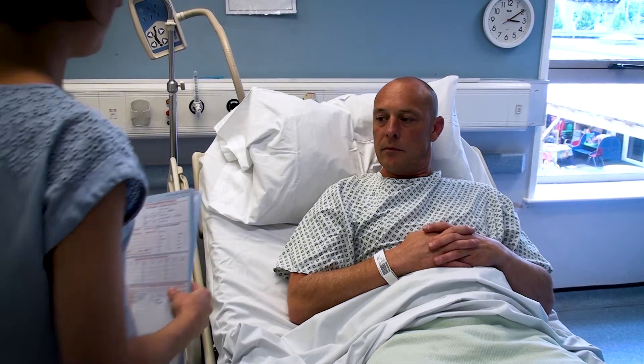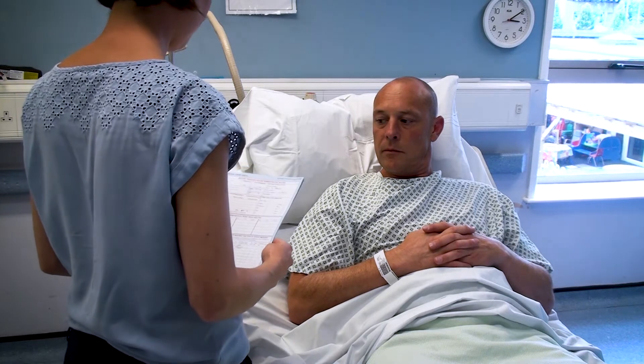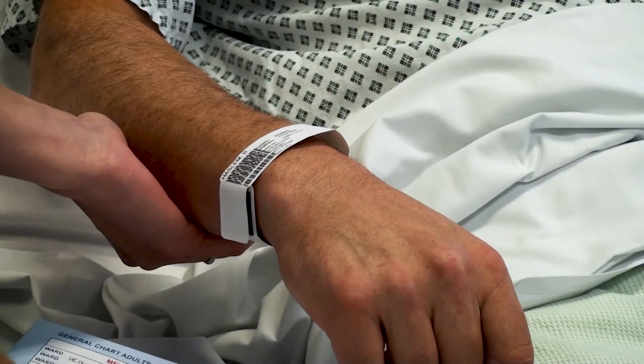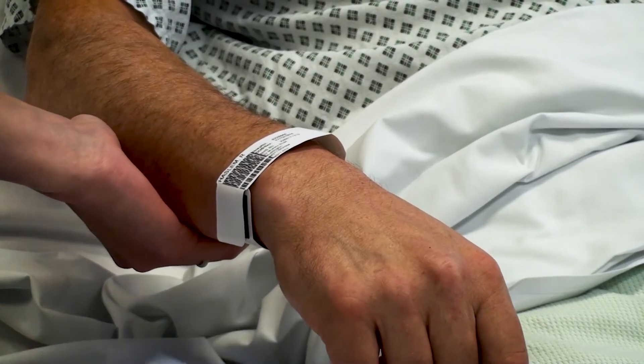Welcome to the clinical skills video for peripheral venous cannulation. Prior to performing any procedure on a patient, you must ensure that you have got the correct patient and that the patient is fully aware and informed of the procedure you're about to perform.